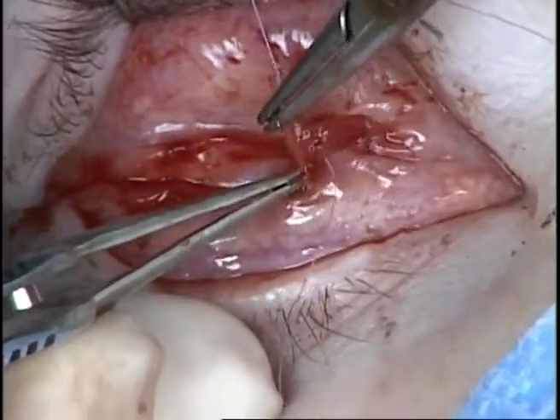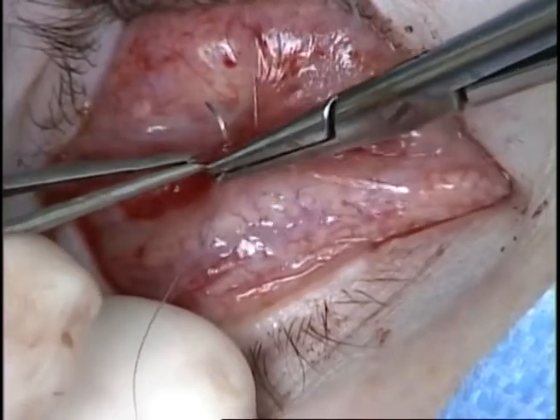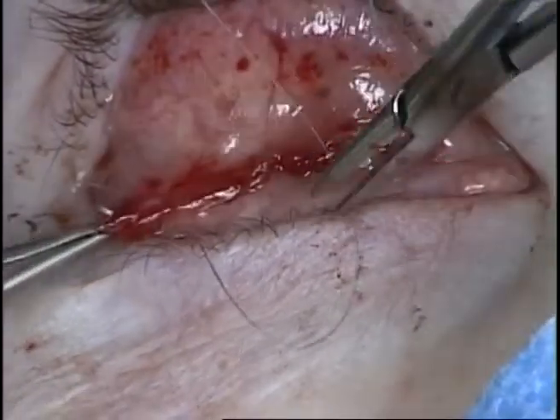At the conclusion of the case, a conformer is placed with antibiotic ointment and the eye is patched for at least 4 days. The patient returns in one week for re-evaluation.